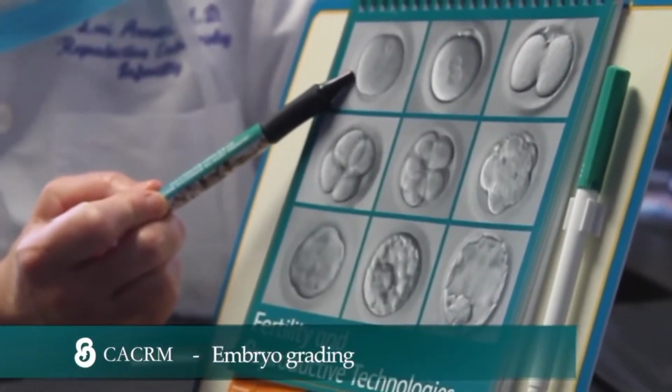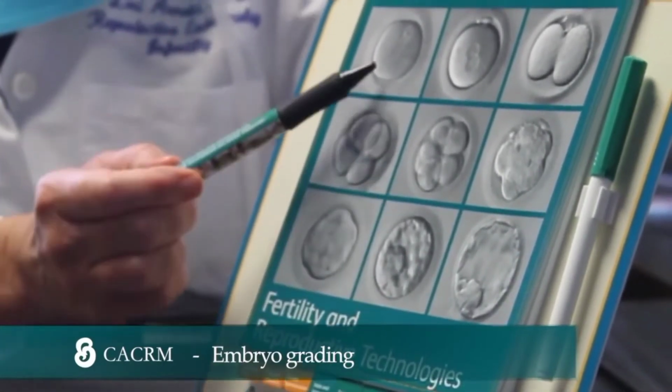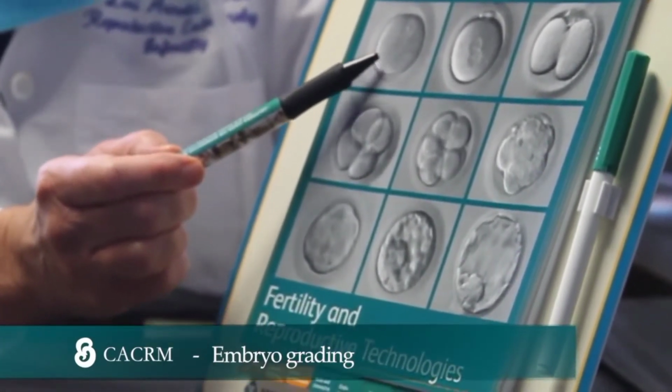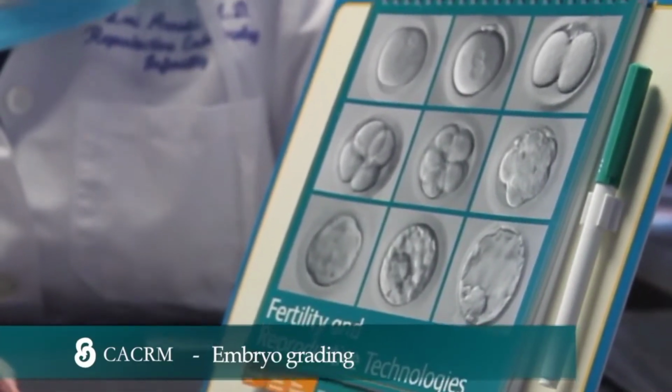The eggs are looked at under the microscope for the maturity of the eggs. There are 4 different levels of maturity of an egg: a germinal vesicle egg, which is very immature, a metaphase 1 egg, a metaphase 2 egg, which is the mature egg, or there's a atretic or post-mature egg. We can only use metaphase 2 or M2 eggs for the process of fertilization.